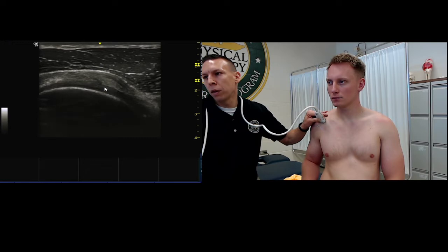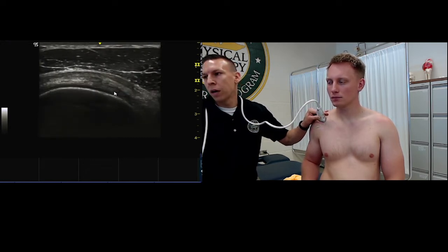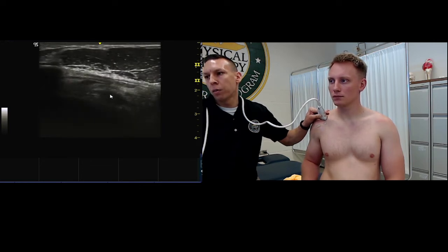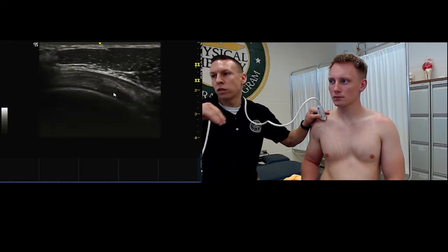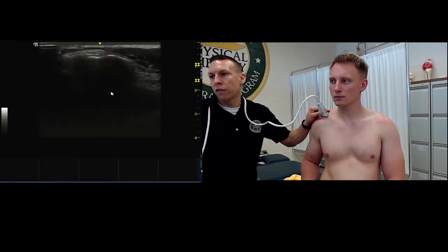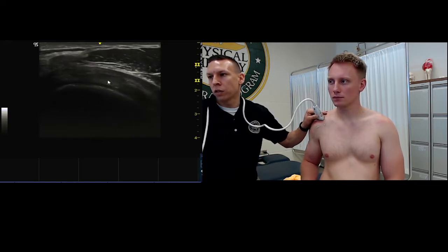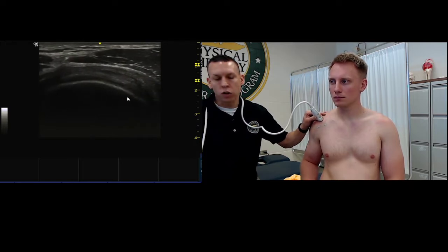And we're going to probably lose it a little bit as we keep coming up. But you can try to visualize it as far up as you can go. But you're probably going to lose it the further up you go. It's going to kind of dive underneath the acromion here. And so right here's the acromion. But it's going to dive under some of these osseous structures.